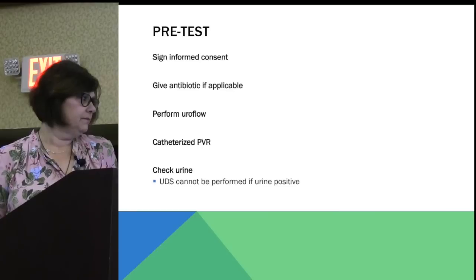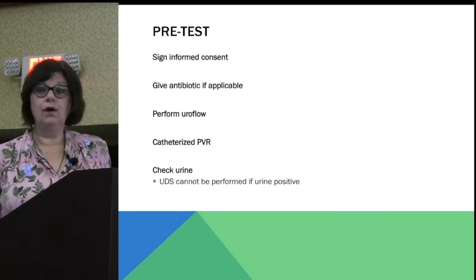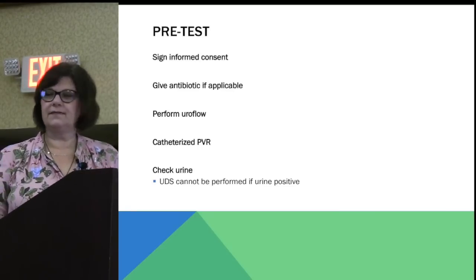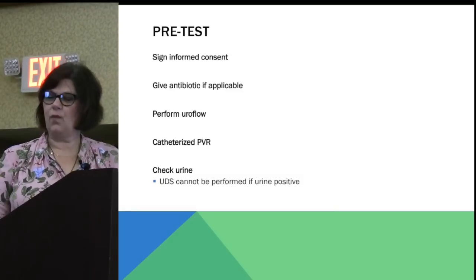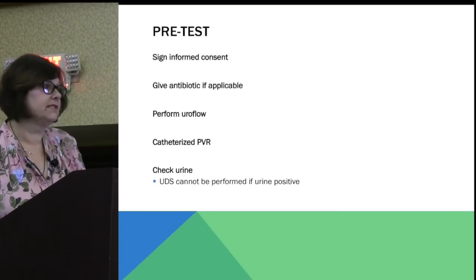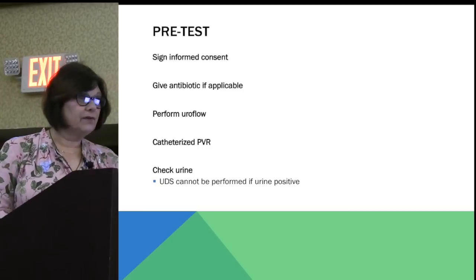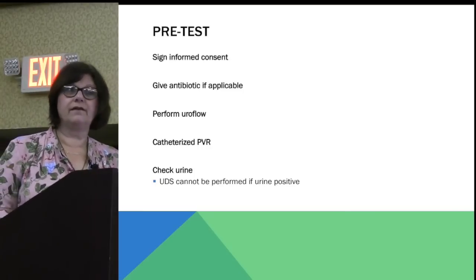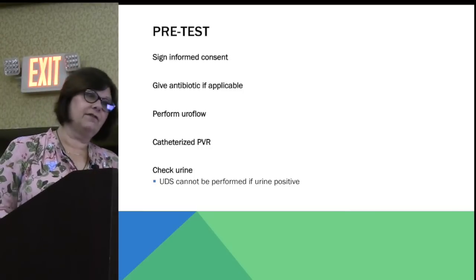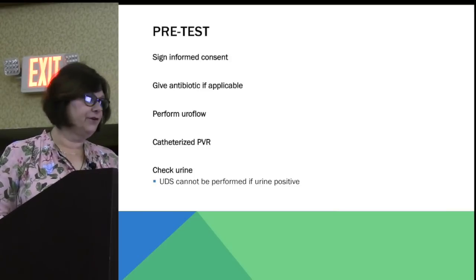And then after the uroflow or prior, it's done a lot of different ways as well, but most commonly, you're not going to do urodynamics on someone who has indications of a UTI, okay? Every once in a while, there's an exception to that. Like if the patient has a Foley catheter in, that's their norm, more often than not, the urine is going to look infected. That's up to you and your provider.